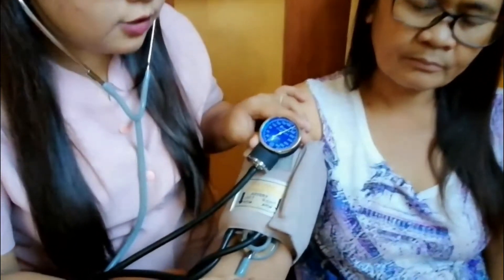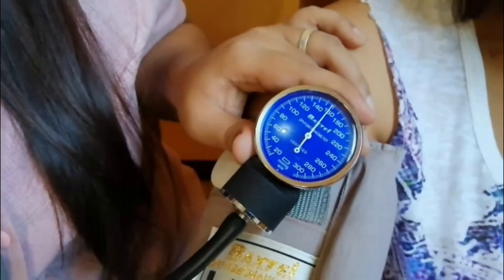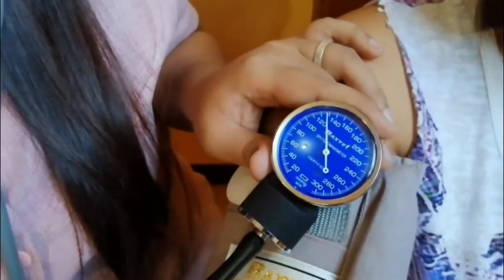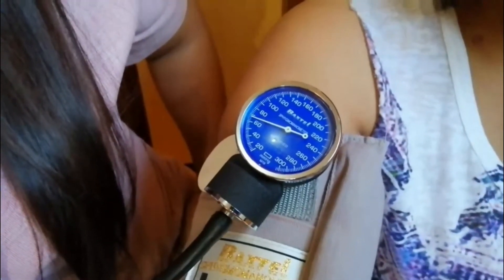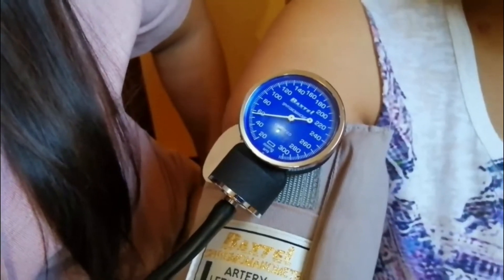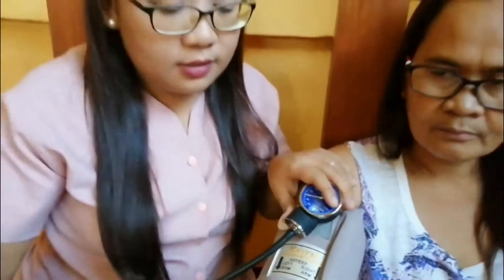Release the bulb slowly and gradually deflate the cuff. The systolic pressure — the first beat — is 120, and then the diastolic pressure is 80. That means my mother's blood pressure is normal.